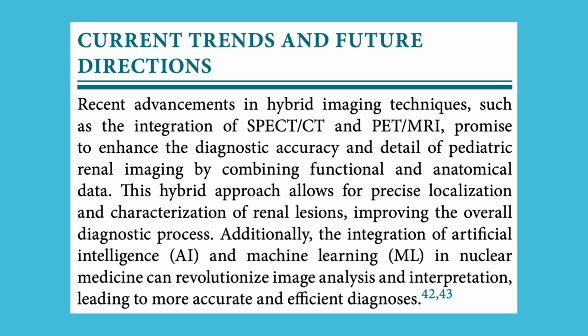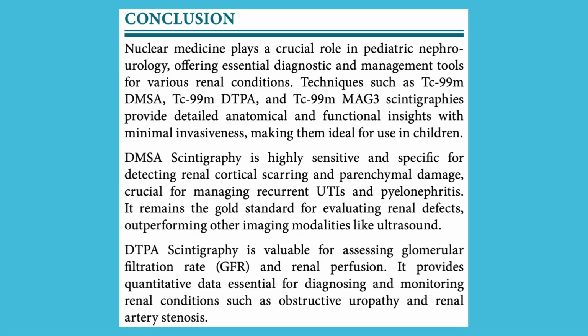Additionally, the integration of artificial intelligence, AI, and machine learning (ML) in nuclear medicine can revolutionize image analysis and interpretation, leading to more accurate and efficient diagnoses. Conclusion. Nuclear medicine plays a crucial role in pediatric nephrourology, offering essential diagnostic and management tools for various renal conditions. Techniques such as Tc99m DMSA, Tc99m DTPA, and Tc99m MAG3 scintigraphies provide detailed anatomical and functional insights with minimal invasiveness, making them ideal for use in children.